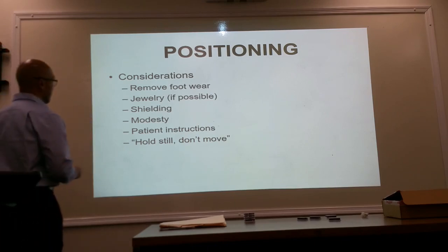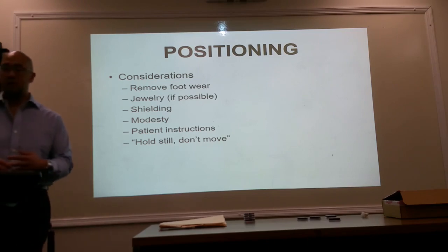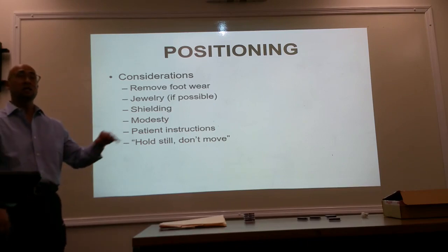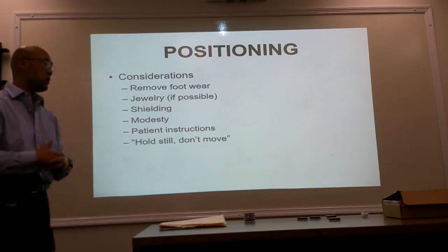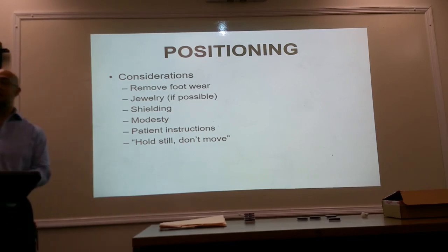Okay? Shielding. Get in the habit of shielding your patients. Modesty. Now the legs are going to be flopping all over the place, and as I will show you later with our images and how to acquire those different radiographs or images, you're going to need to make sure that your patient is covered at all times.